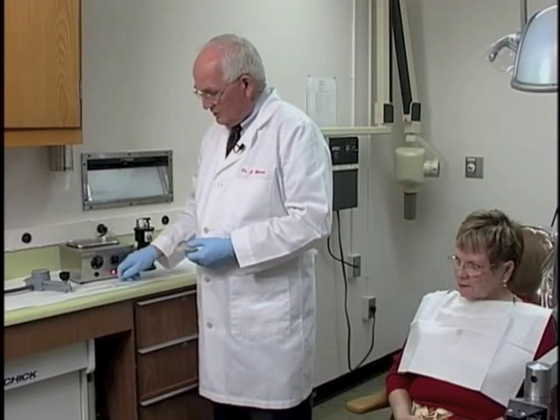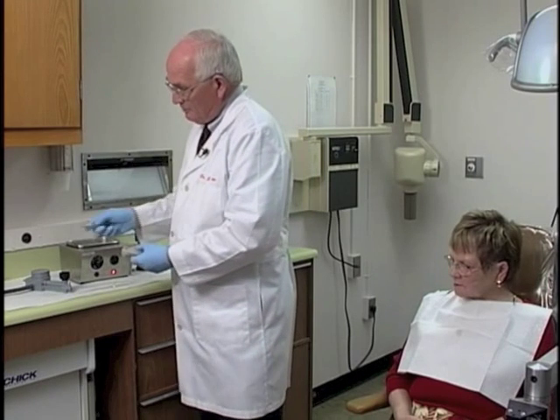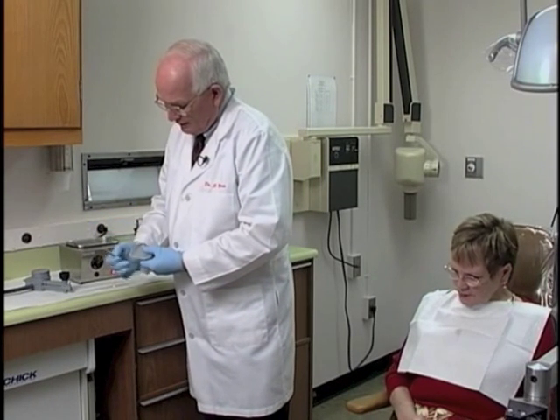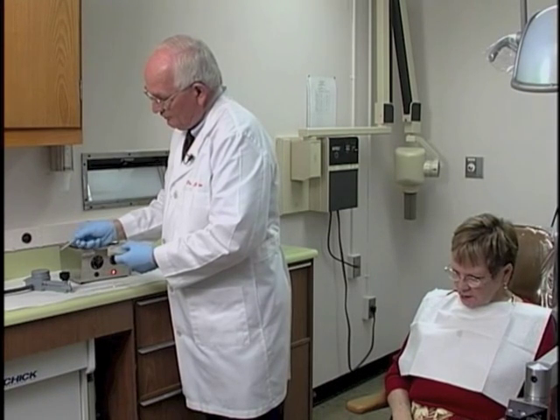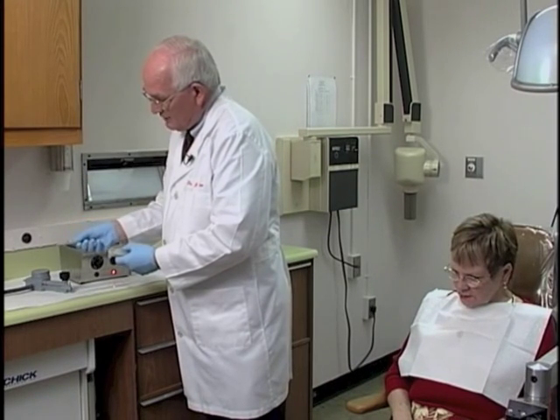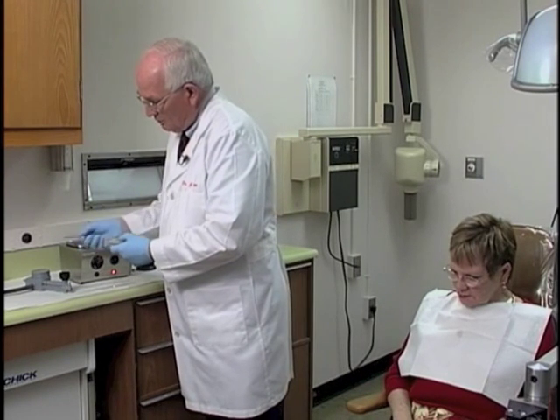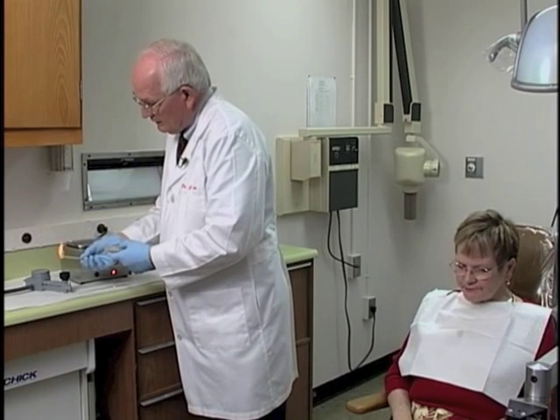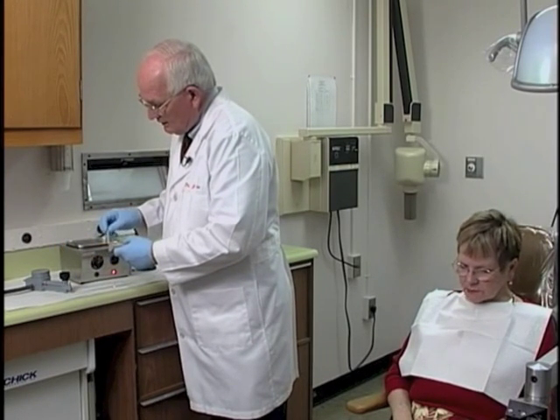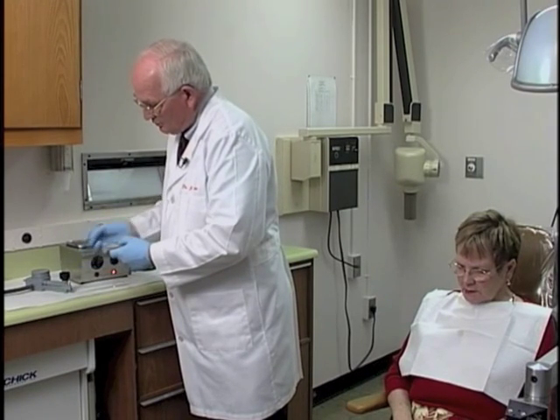Okay, border molding, the third section of it will be across the labial from buccal frenum to buccal frenum. So we're going to heat the compound in the flame, get it very, very soft. Doesn't matter which technique you use, in the flame or off or above the flame. And we'll heat the compound and apply the material to the periphery.